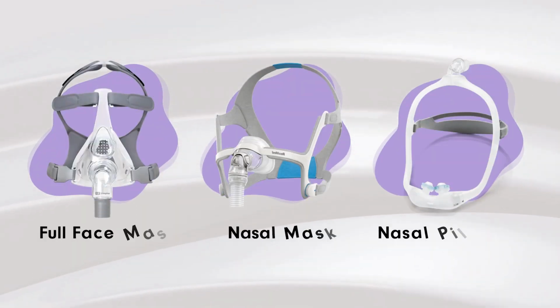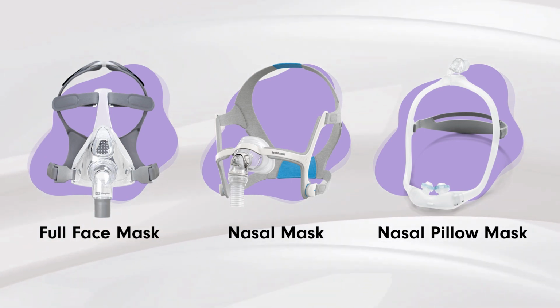You can also help the issue by increasing your humidifier. If you have a lot of issues with dryness and problems with humidity, you can also change the tubing to a climate tubing. Once again, you can speak to your physician or talk to your provider and ask them for a climate tubing option. Climate tubings are tubings that regulate humidity and temperature separately. So they help you be more humidified, to help you better assimilate a mask, whether it's nasal or full face.